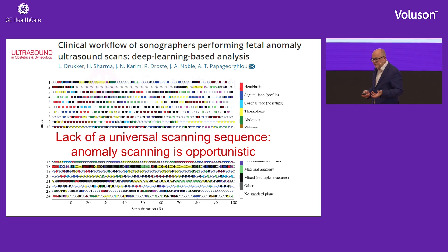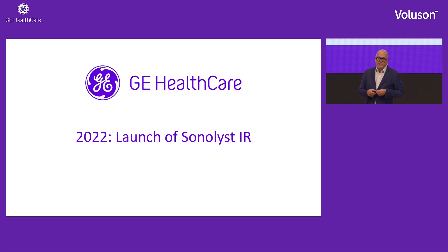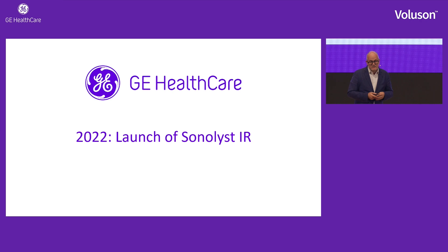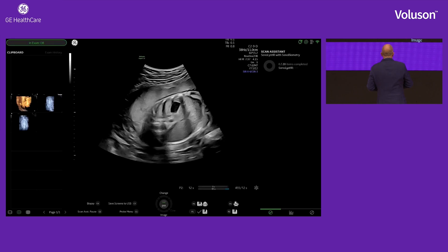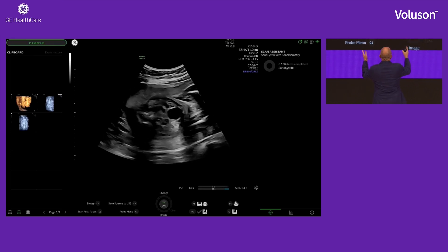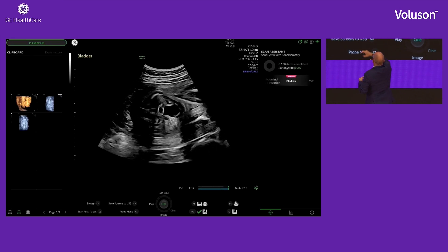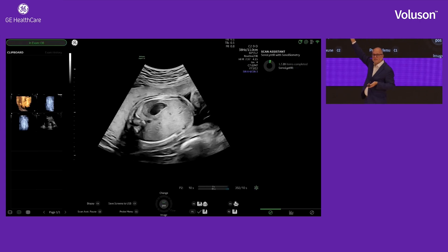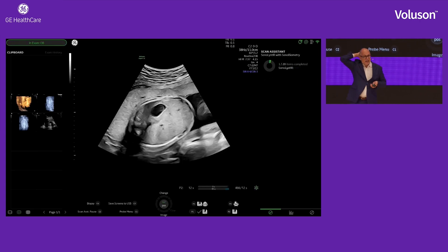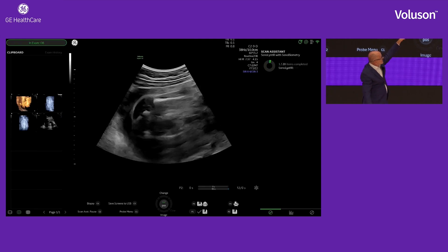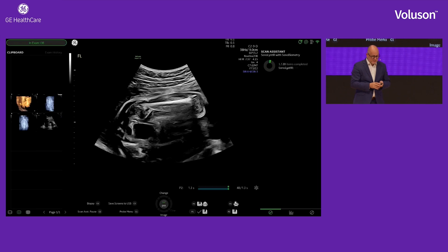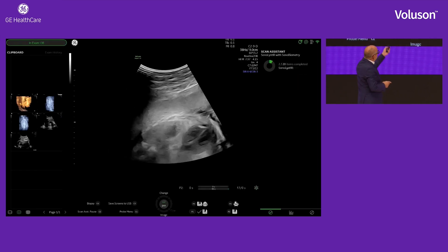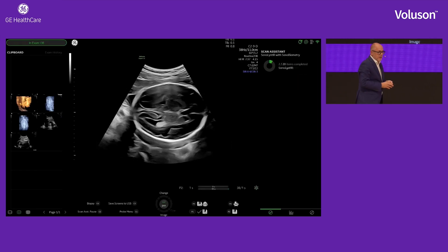In order to help with these challenges, a year ago in collaboration with GE, GE launched Sonalyst IR, which stands for image recognition. During the scan, when I freeze the image, two things happen: on the top left a label comes up automatically — for example, 'this is the fetal bladder' — and on the right there's a little pizza wheel which allows us to track all 20 images we need to gather during our fetal anomaly scan, and it gradually fills that in.